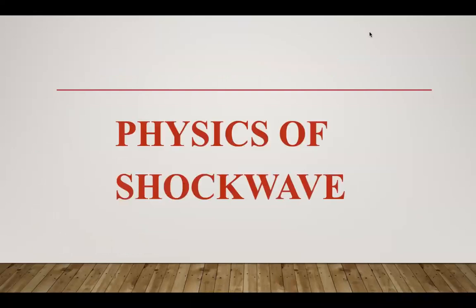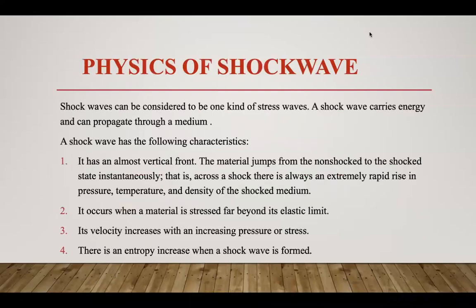Next is the physics of shock waves. A shock wave can be considered to be one kind of stress wave. A shock wave carries energy and can propagate through a medium. A shock wave has the following characteristics. Number one, it has an almost vertical front. The material jumps from the non-shock to the shock state instantaneously. This is across the shock.